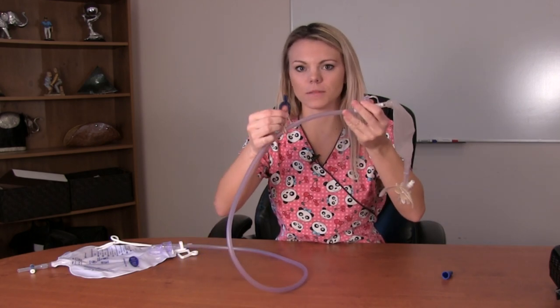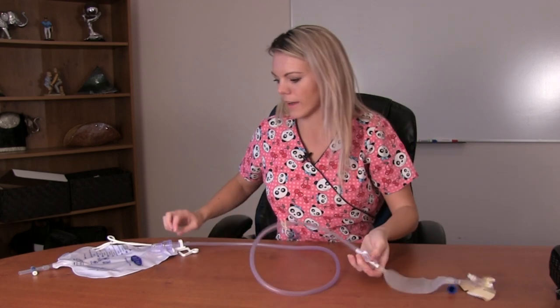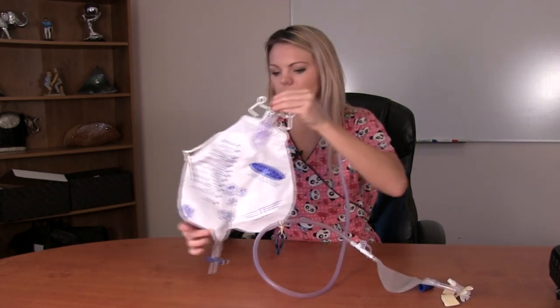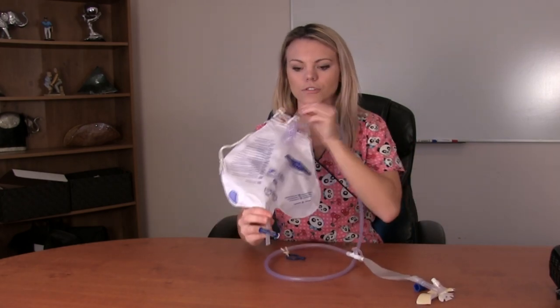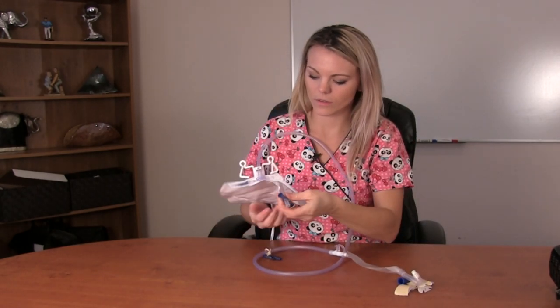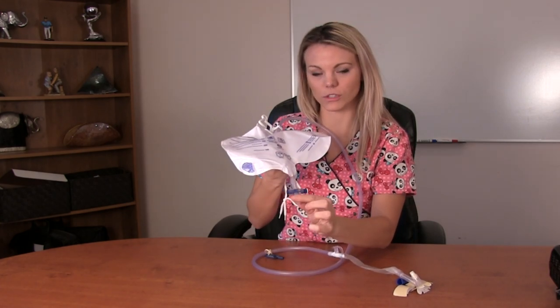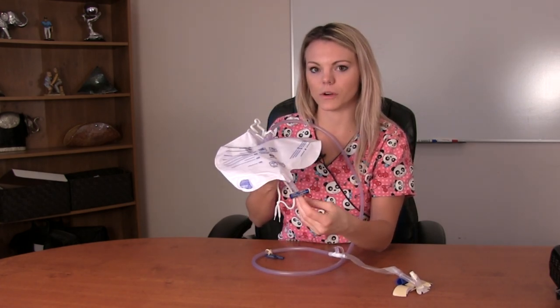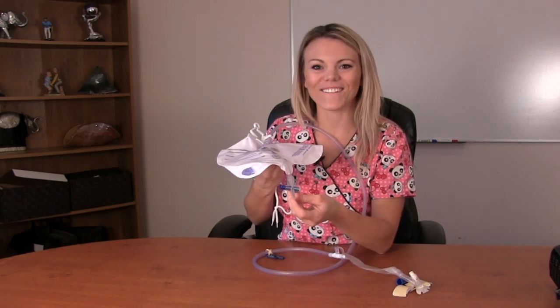Then you have a little clip here. This can be clipped onto a bed sheet to help guide the tubing down to the bag. This is the night bag, and at the very bottom there is a drain. You'll see one way it is closed — you always want to keep it closed unless you are emptying it or draining it or cleaning it.